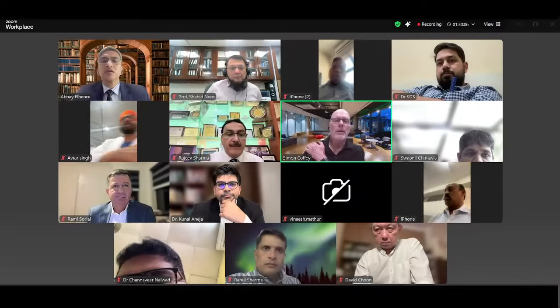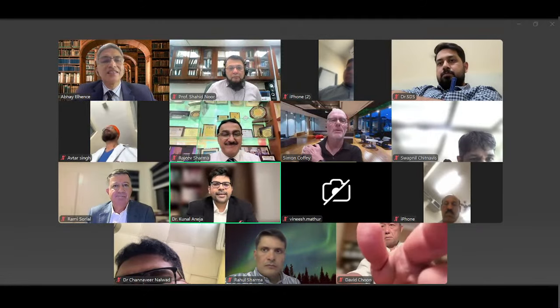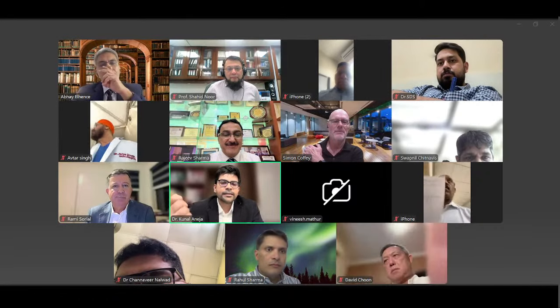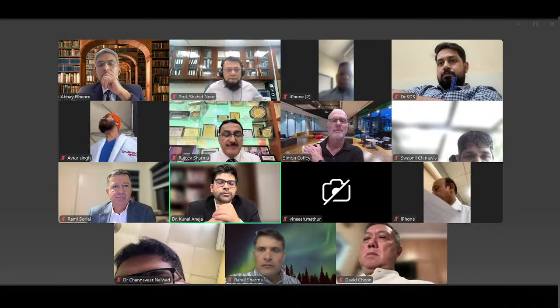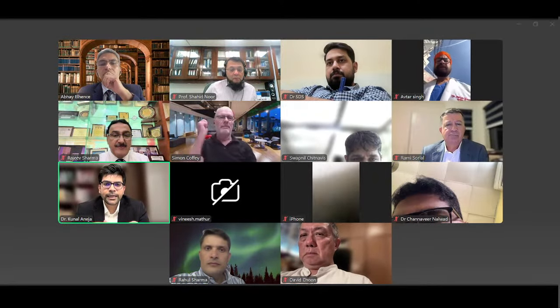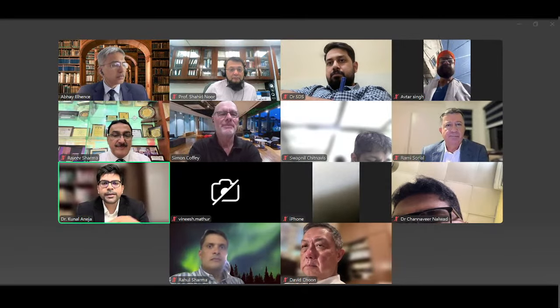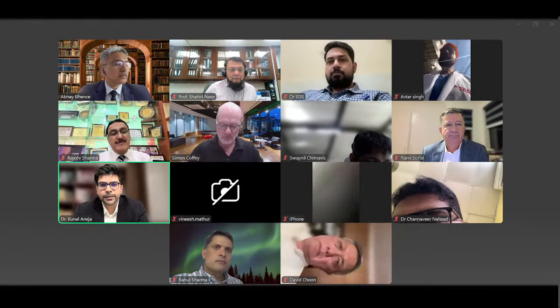How much is 4,000 newtons of impact? Have you ever measured how you impact? I read that paper. What they have described is that a standard hammer, the mallet you're using, has to come down from 15 centimeters. So a single blow for engaging the head onto the neck, but it has to be a clean environment, no blood, no fat on the taper. Otherwise, there are chances of loosening.